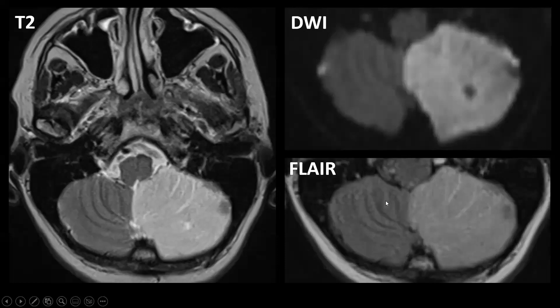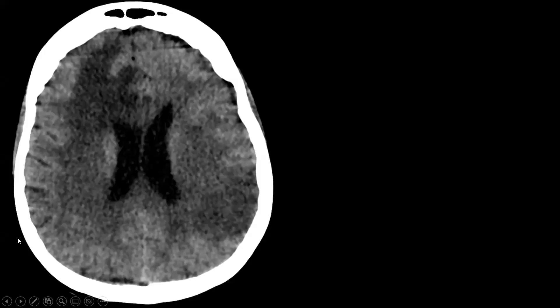MRI findings in another patient with a PICA infarction show T2 and FLAIR oedema of the left cerebellar hemisphere with diffusion restriction. In another patient with acute aphasia and an oncological history, there are areas of oedema — the question is: what is due to brain tumour and what is ischemic stroke? Is everything tumour? Is everything stroke? Hard to tell — or is it?